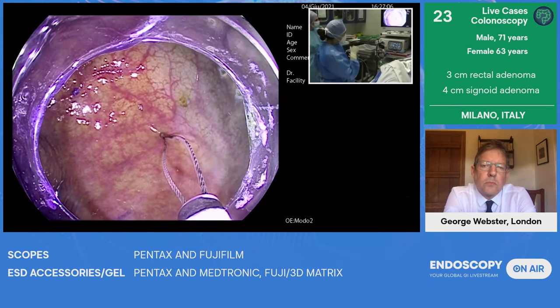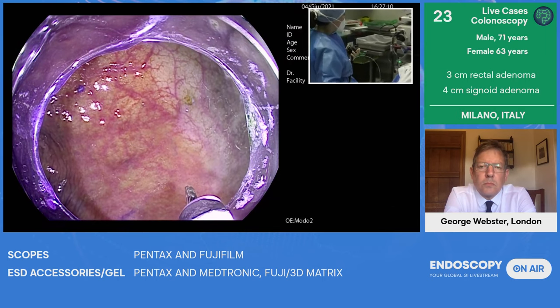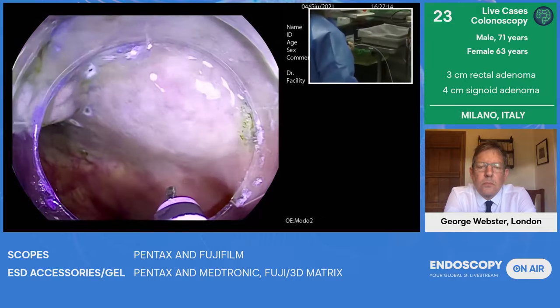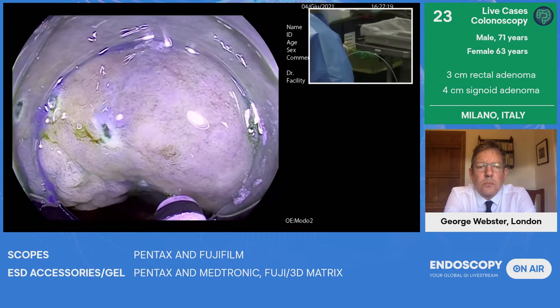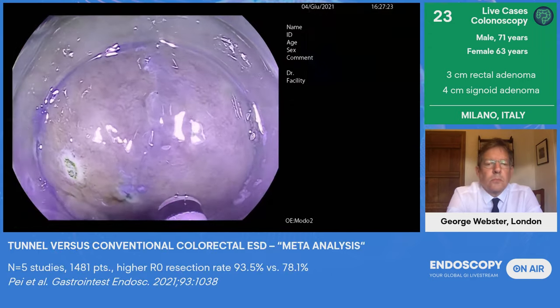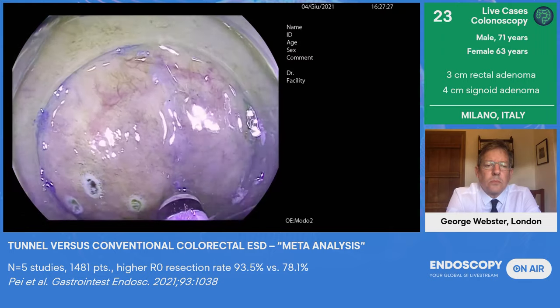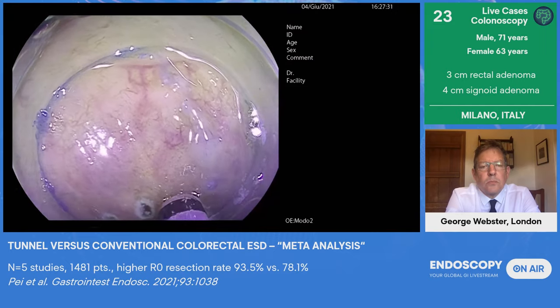Okay, just open the tip. So you can see that the tip is squared. So I will apply, I'm using a VIO 3 electrosurgical generator from Erbe. So outside from my mark, I will simply apply the yellow current, the yellow pedal, that is the EndoCut Q, to make my circumferential incision.